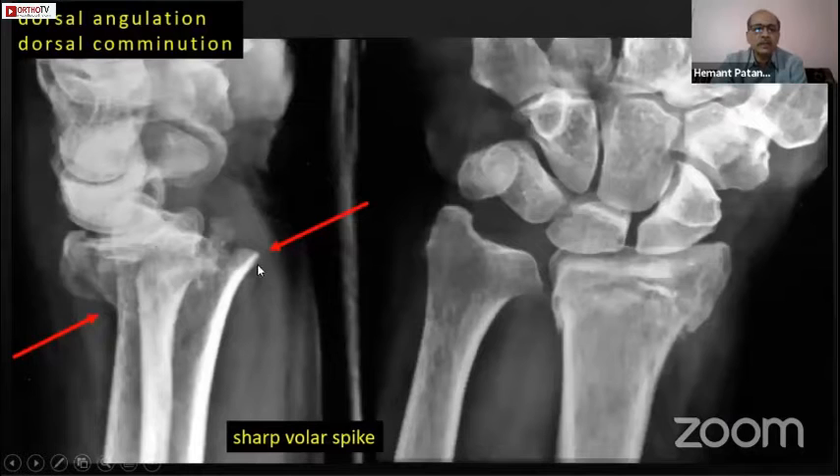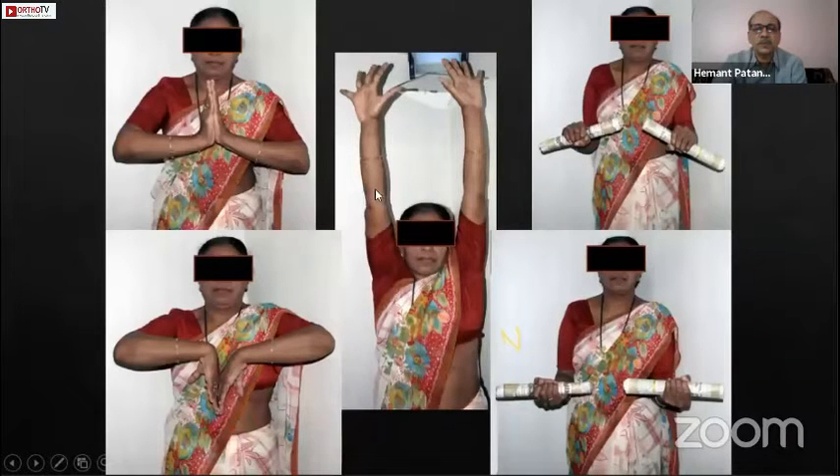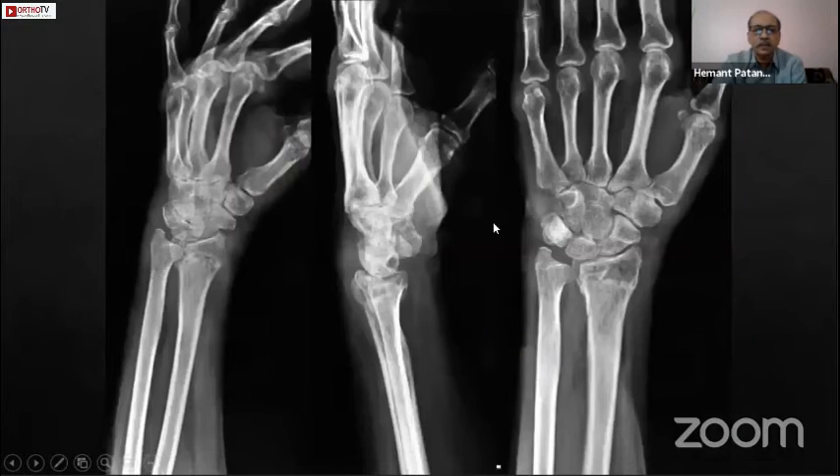This case again illustrates that a sharp volar spike causes loss of reduction. Dorsal angulation and comminution are very important to assess. The radial styloid is a slightly volar structure, so one K-wire has to pass in the midline and one slightly on the dorsum to give a good hold, ensuring the volar part is reduced. That is the post-operative picture of this patient treated in plaster — you can see all radiological parameters are very well maintained.